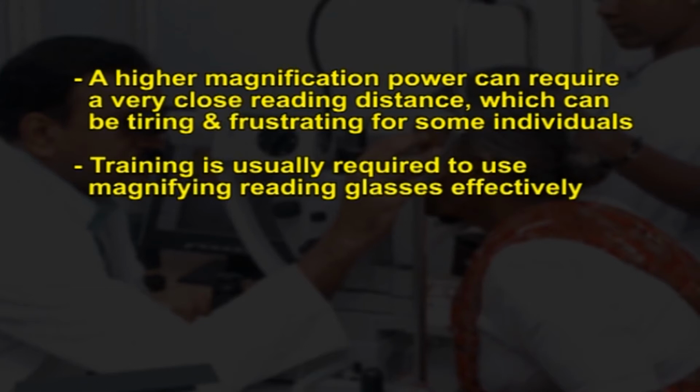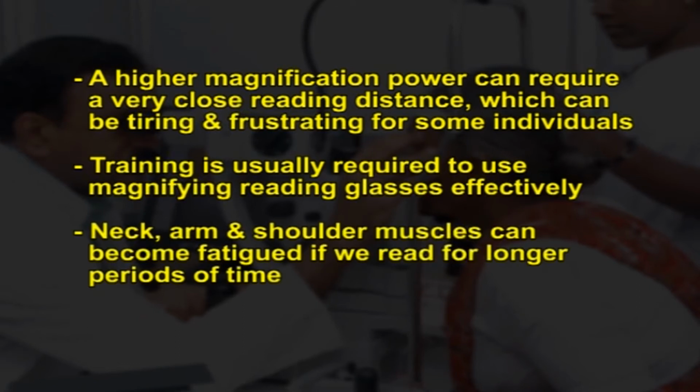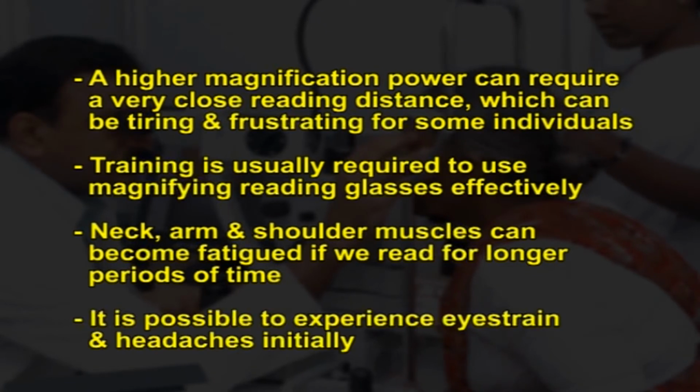Training is usually required to use magnifying reading glasses effectively. Neck, arm and shoulder muscles can become fatigued if we read for longer periods of time. It is possible to experience eye strain and headaches initially.